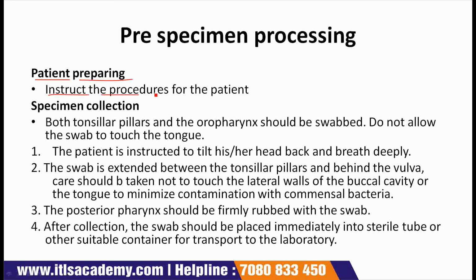Instruct the procedure for the patient. Next comes specimen collection. Both tonsillar pillars and the oropharynx should be swabbed. Do not allow the swab to touch the tongue.